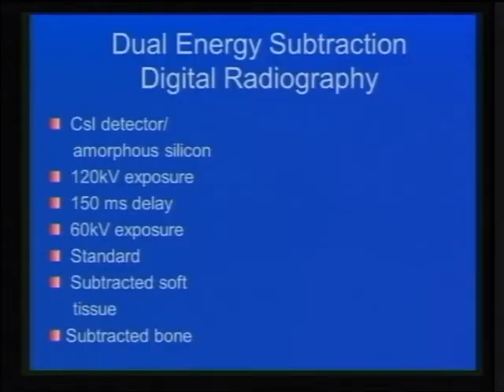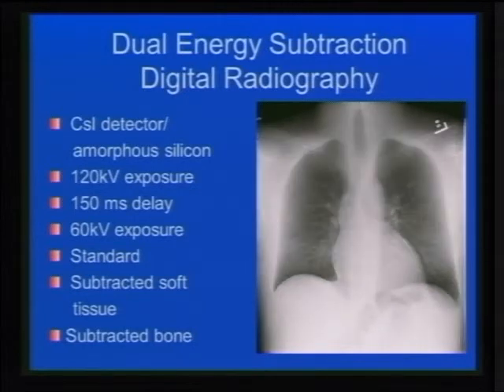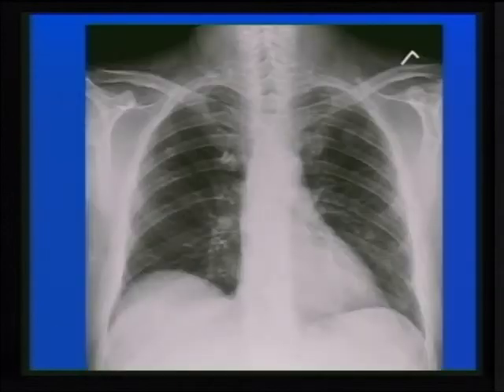Dual energy, our colleague before me talked about dual energy. Dual energy also, 20 plus years ago, was played with on chest X-rays, but it is something that never took over. It allowed us to basically remove the ribs and be able to see the lung parenchyma almost like tomography, but it's still a relatively expensive modality. It does have some increased radiation, so it never took off.